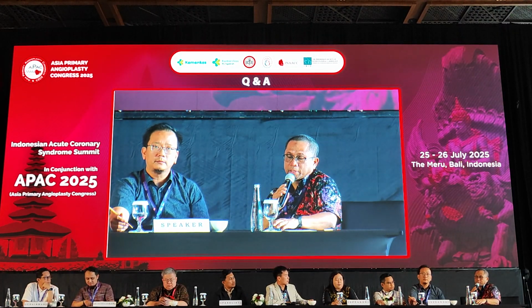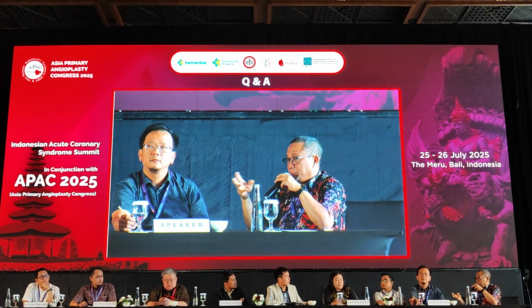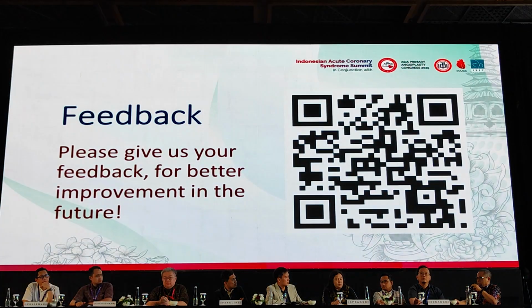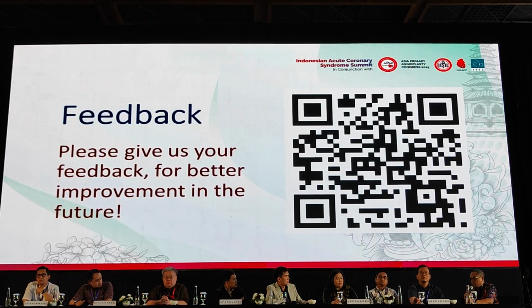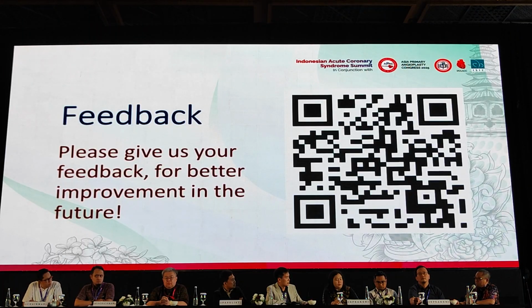In my daily practice, we use the imaging.